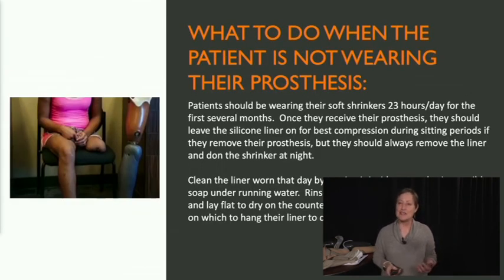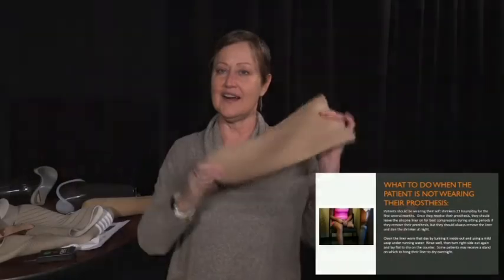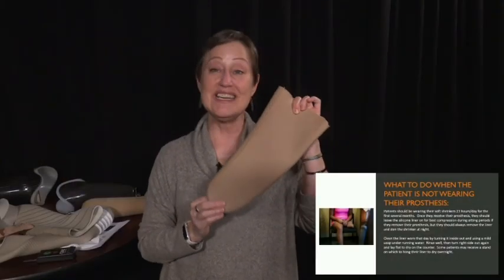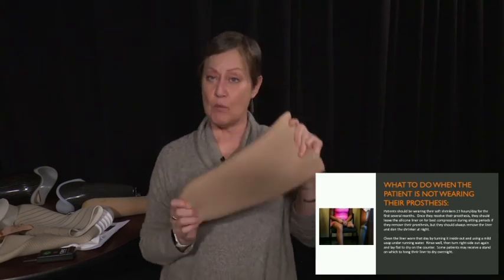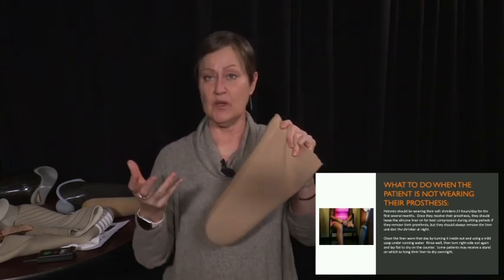What to do when the patient's not wearing their prosthesis? So they should be wearing their shrinkers, especially early on. And by early on, I mean 6 months at least. When they're not wearing their leg at night, they wear their shrinker. So I didn't talk about not wearing these at night. Please, patient, never wear your liner at night. So they wear these during the day when they have their leg on.